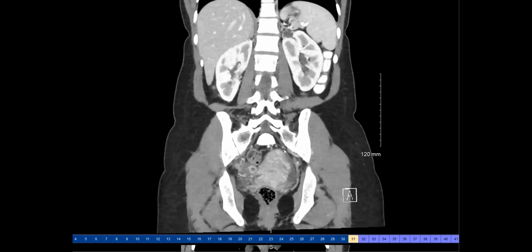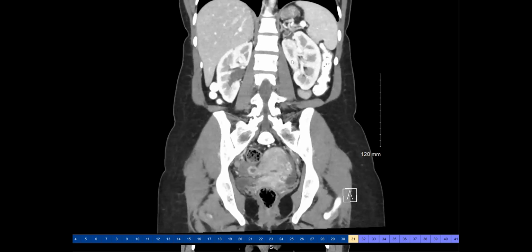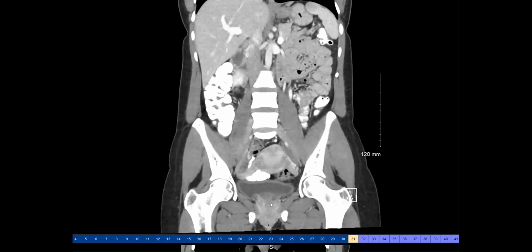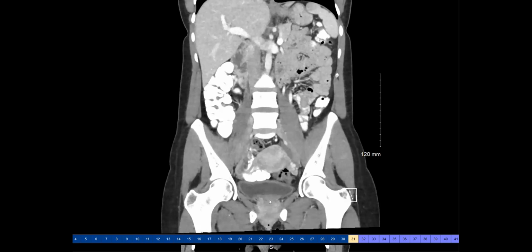Here, you can follow this ureter, and this ureter actually joins the lower pole moiety, but this ureter is ectopic and inserts into the urethra. So this kidney doesn't really follow the Weigert-Meyer law, or maybe it follows somewhat, wherein the upper pole is atrophic, but we can't trace that ureter, and the lower pole ureter you can trace, and it looks like that one, the lower pole, is ectopically inserted into the urethra and refluxing as well. So I thought that was interesting.